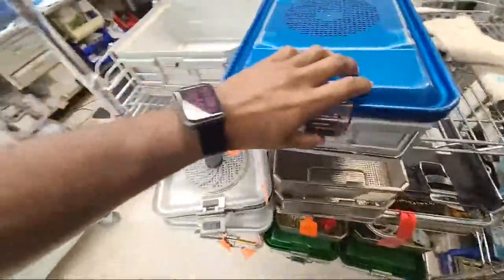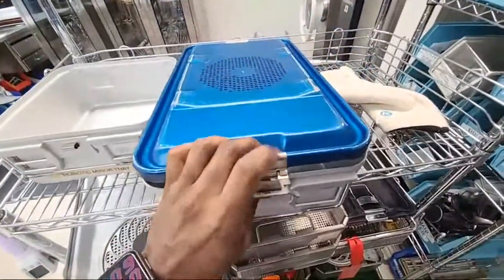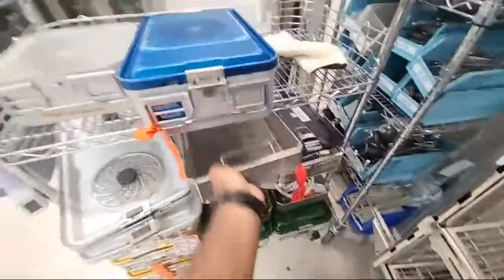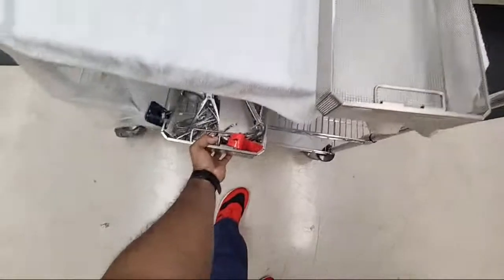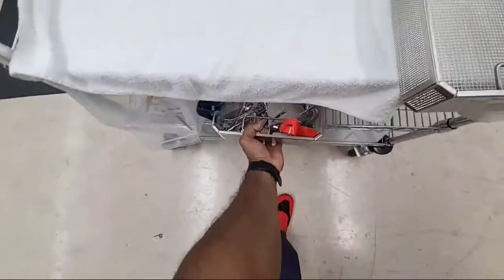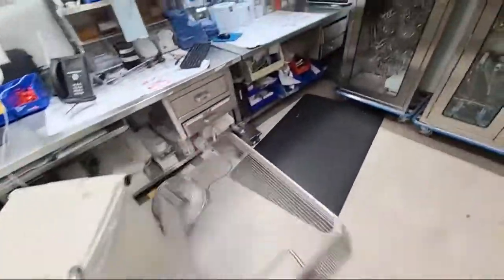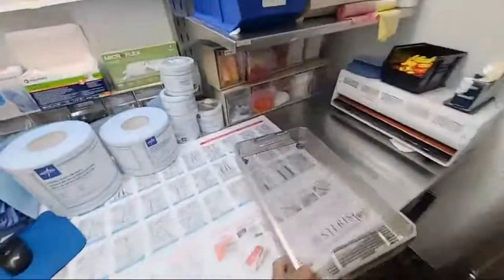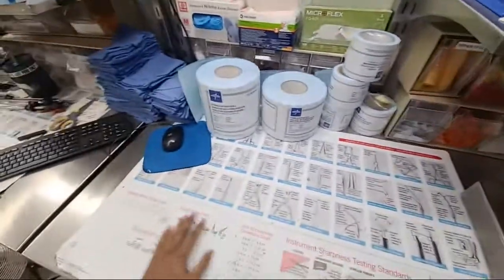Everything actually finished on time today. Everything's early done. So here's a rigid container that we put trays like this one. Here's an empty tray. So normally it would be full of instruments similar to this. These are some extras, new ones that we have for replacements. So we'd have a tray full of instruments that we would dump out carefully, either one by one or just carefully tipping them over. We have to protect our instruments. We don't want them damaged.